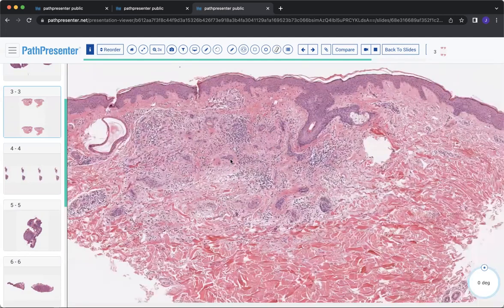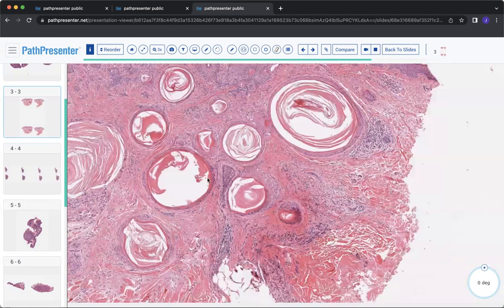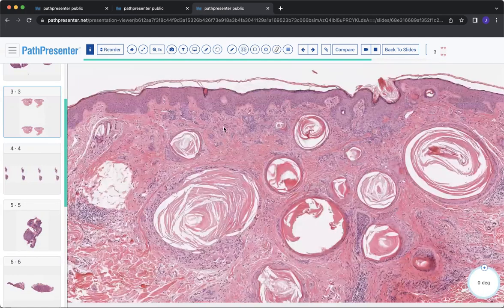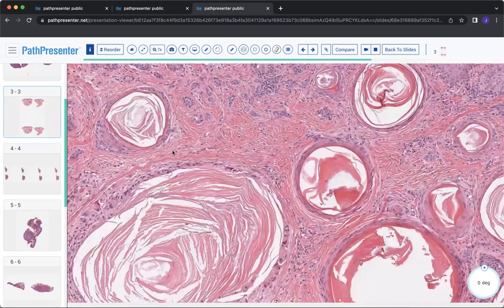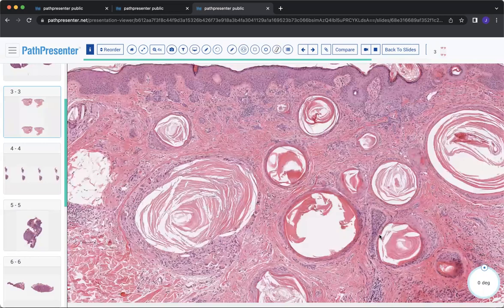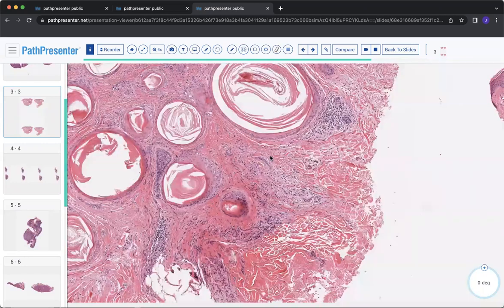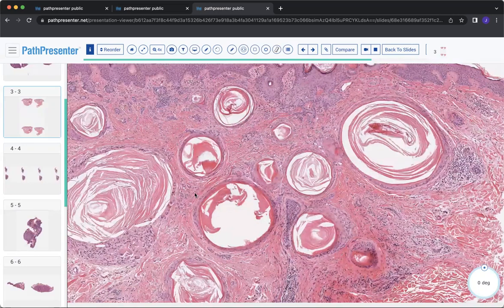And so sometimes you'll get variations on the theme, and you may get a trichoadenoma that has more of these keratinocyte-derived neoplastic cells here. But more often than not, a classic trichoadenoma is going to have more of these milia-like cysts here. So this is called a trichoadenoma.